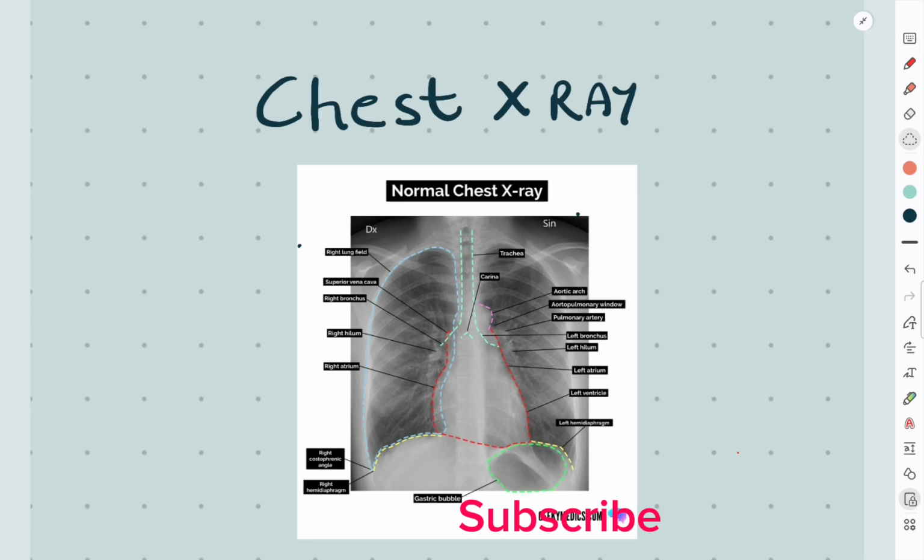Treat every film like a formal process. Check details, evaluate RIPE quality, step through ABCDE.